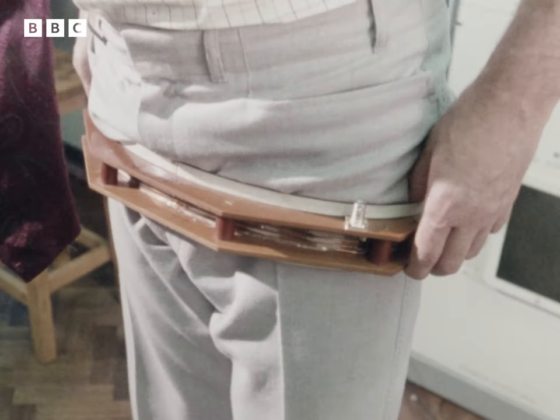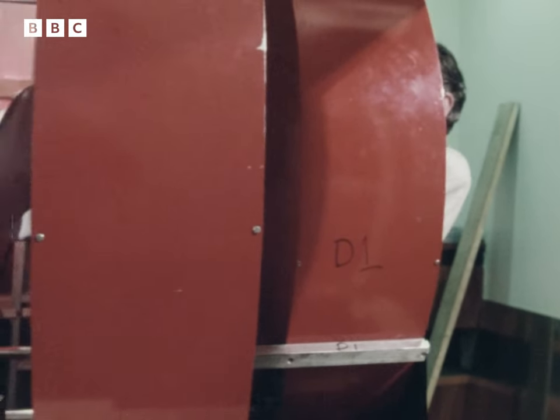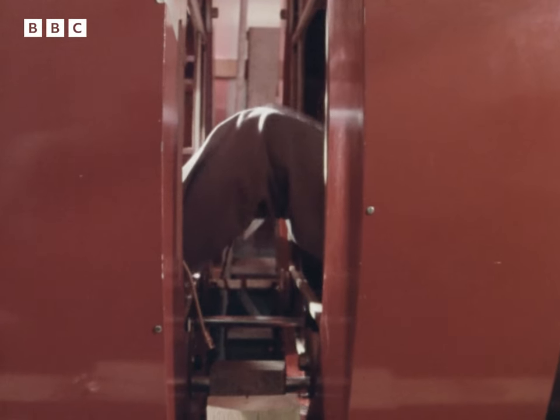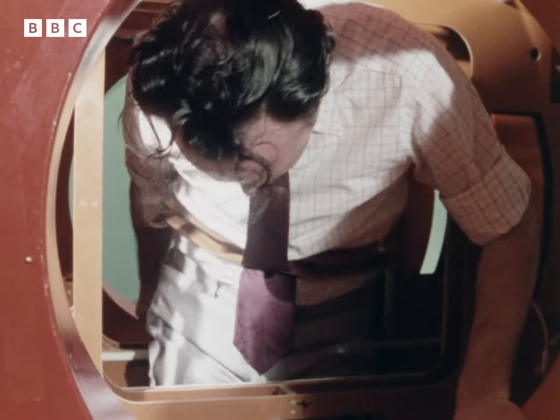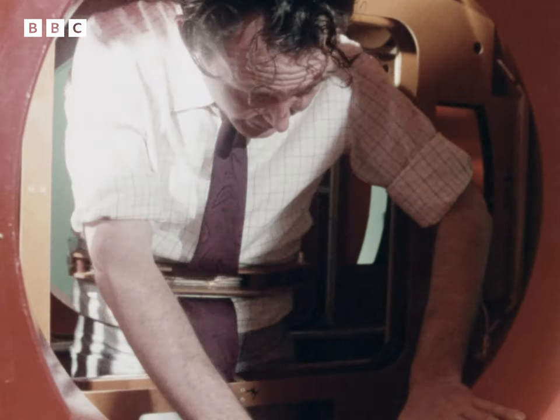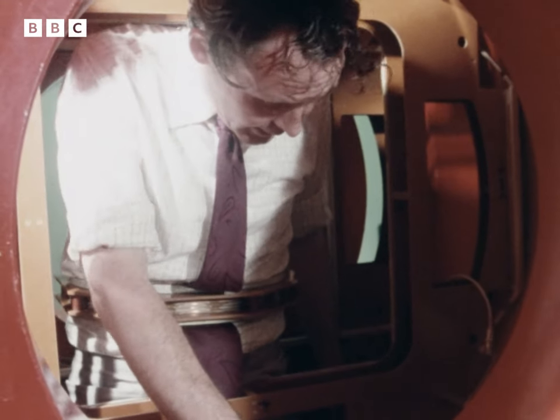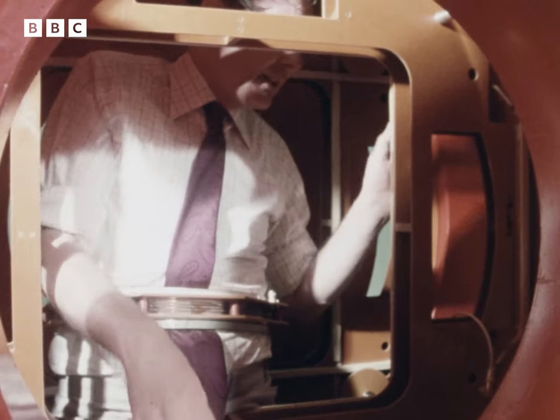This band will pick up signals from inside his body. His technique depends on two facts: that our bodies are made up mostly of water, and that water molecules react when subjected to a strong magnetic field. Though this looks very cumbersome, remember it is an experimental machine, designed primarily to produce a concentrated high magnetic field. There's just enough room for a man to get in.